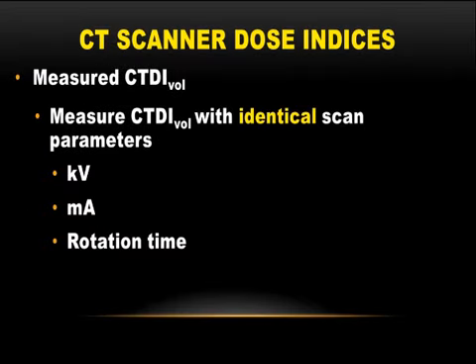So let's do a little experiment. Let's actually measure a CTDI vol. CTDI vol is simply equal to CTDIW divided by the pitch. We needed to develop the CTDI vol term when helical scanning came into vogue. And so what I did in this experiment is I used identical scan parameters for 3 different measurements.